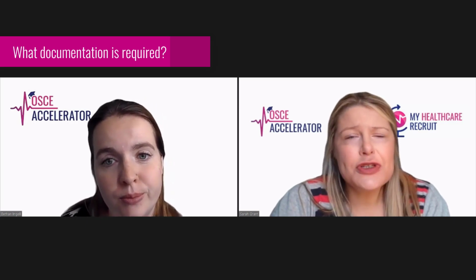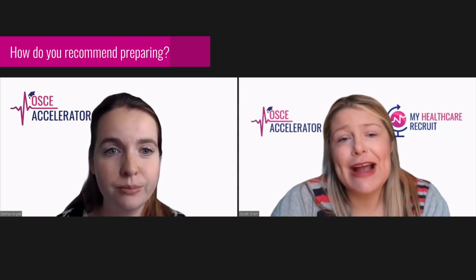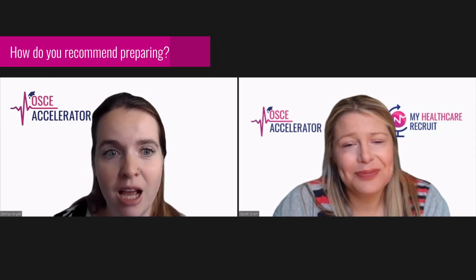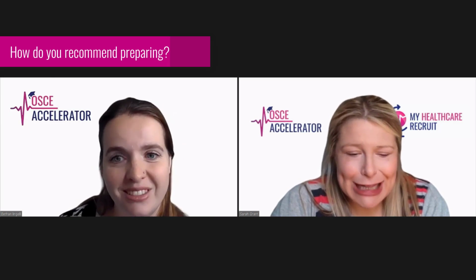Perfect. How would you recommend that candidates prepare effectively for this station? The most important thing, where I've had a few candidates slip up in the past, is that they weren't familiar with how our catheters are here. The ones they have back at home are a little bit different. If you're working in the UK, great, you know what they look like. But if not, please have a look, so you're familiar with where you're going to remove the water from, and it's not the first time you come across it in the exam. Sure, so practice makes perfect in that respect.